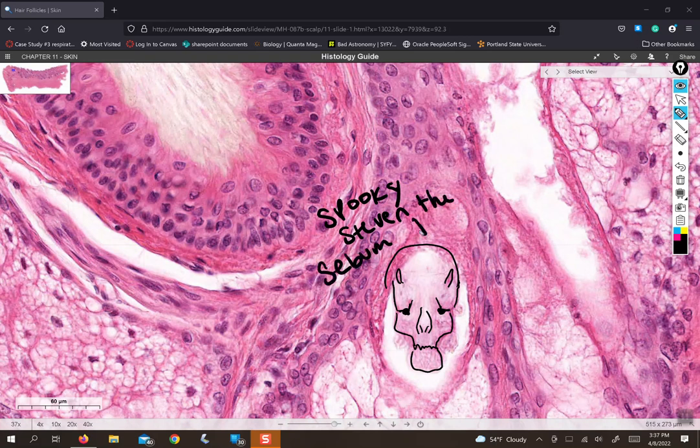That's just an example of human pattern recognition. Human brains are encoded to try and find patterns in our environment. So sometimes people see Jesus Christ on a piece of toast. And sometimes, you're just cruising around a microscope slide and you happen to run into Spooky Stephen, the sebum demon. Hello, Stephen. There you are. But really what that is just dead cells and oil. Sorry, Stephen. Okay, back to business as usual.